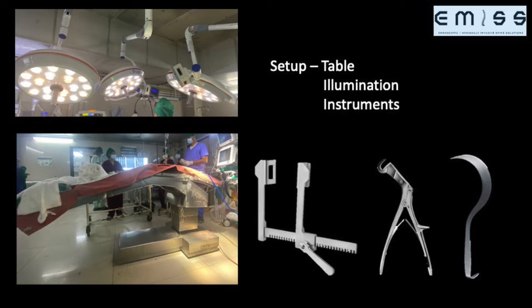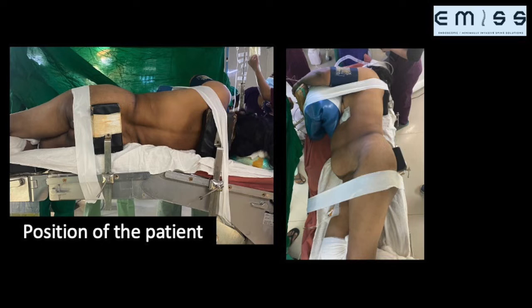This is the position of the patient. I usually keep the patient in the bank lateral position. Break the table open so as to open up the cavity from where I'm approaching. All the bony prominences should be well supported and well padded. The abdomen should preferably be kept free and the iliac crest should be kept open and draped in case you need a bone graft, which I usually do in anterior reconstructions.